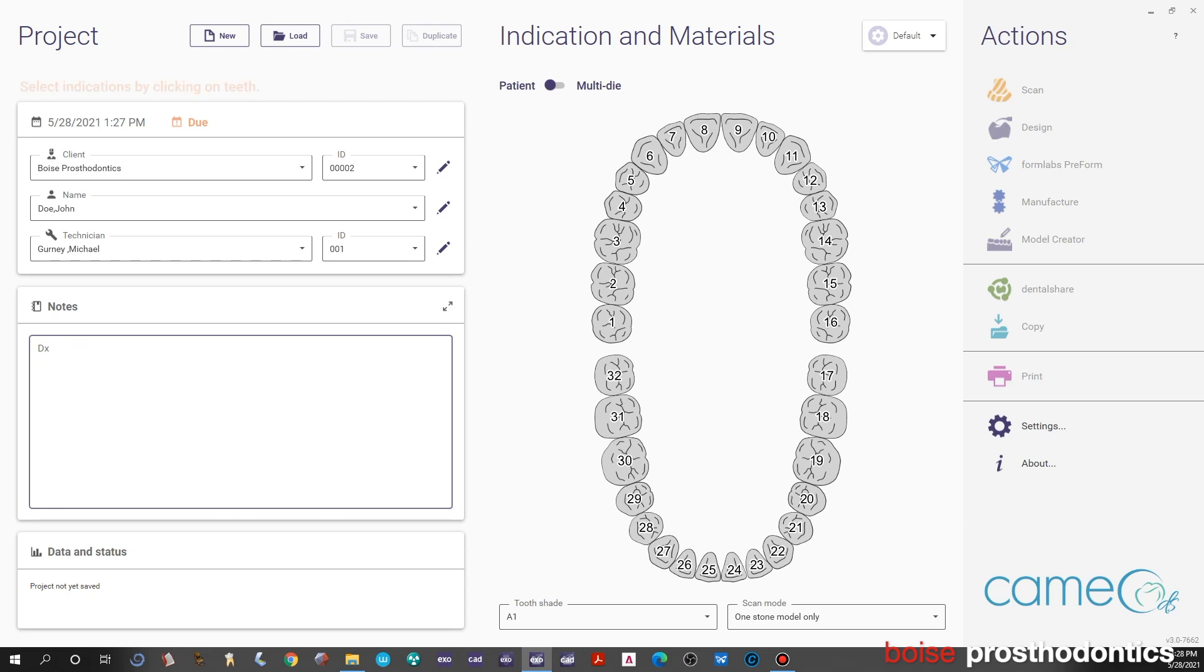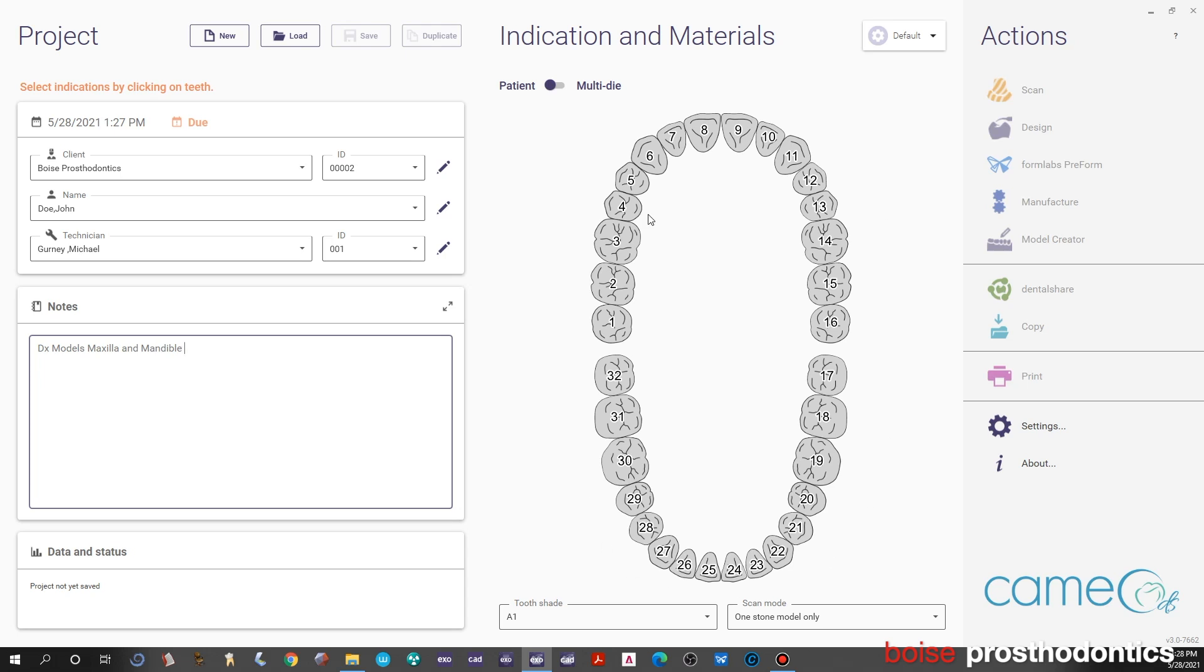You can put in whatever you want in the notes—we're just going to use diagnostic models maxilla and mandible in this case. Now to start telling Exocad what we want to do, just click on any tooth.